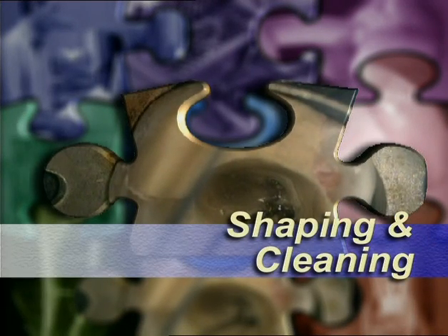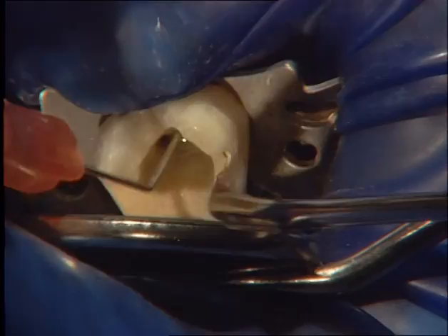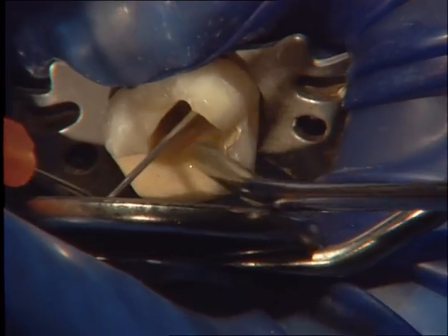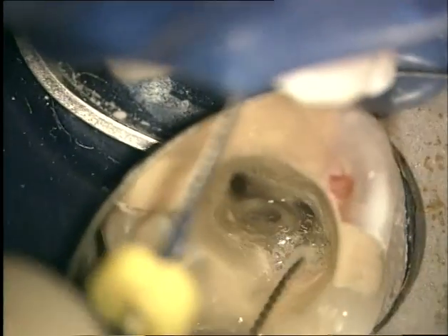The secret to successful clinical endodontics is a proper cleaning and shaping. Cleaning refers to the removal of the entire organic substrate from the root canal system, for example, organic debris, microbes, microbial byproducts.